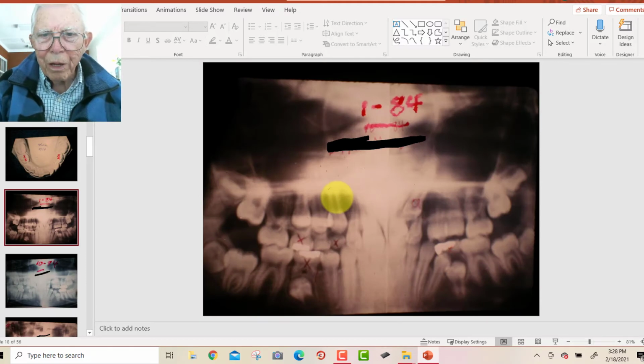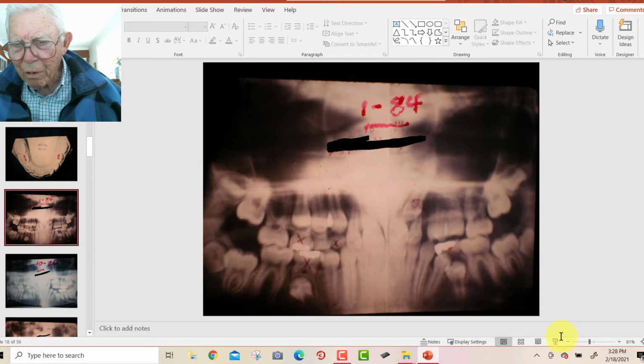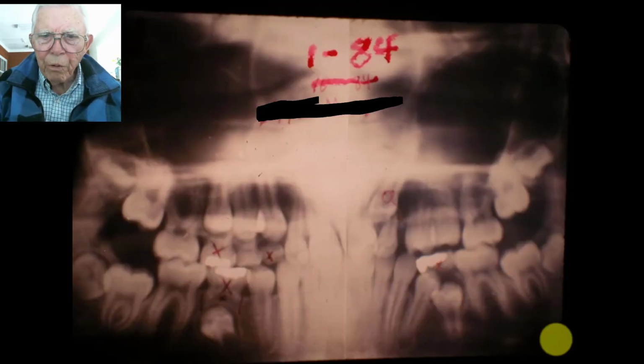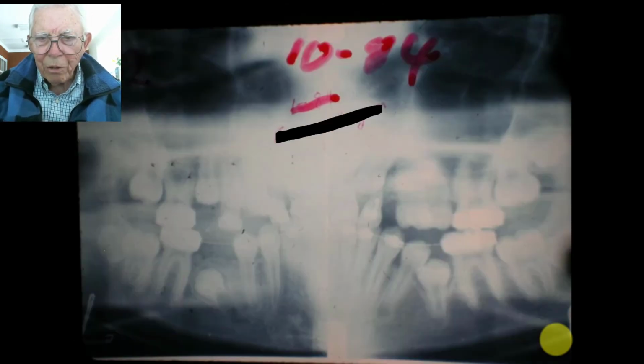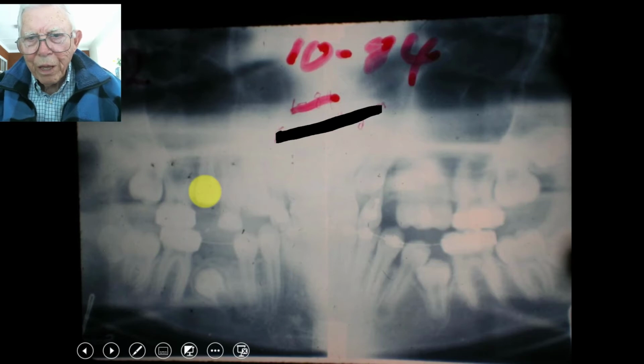Okay. Now I'll have to go back here to the start for a second. Okay. Now we're going to move that cuspid off of that, and you can see we've taken the teeth out to let this erupt up, and we'll have to come down and, well, somebody else took the teeth out.